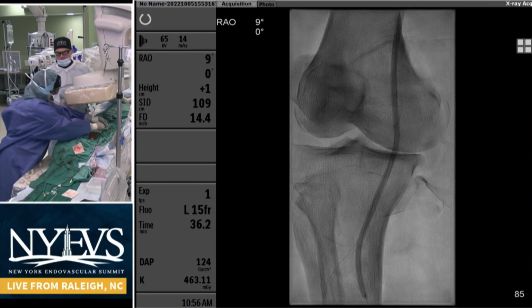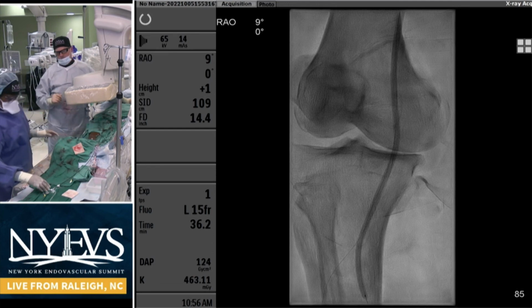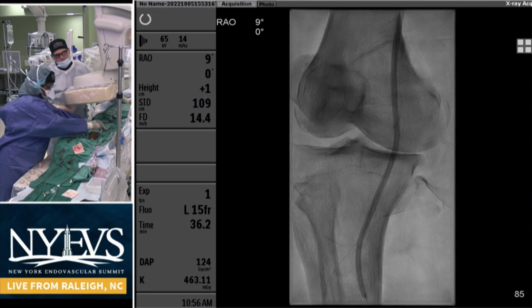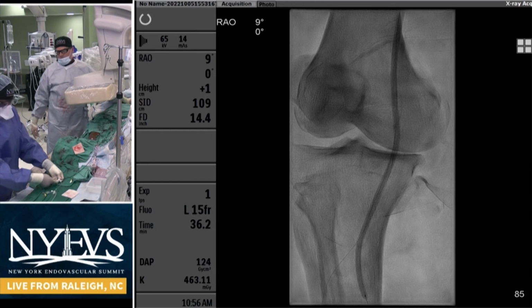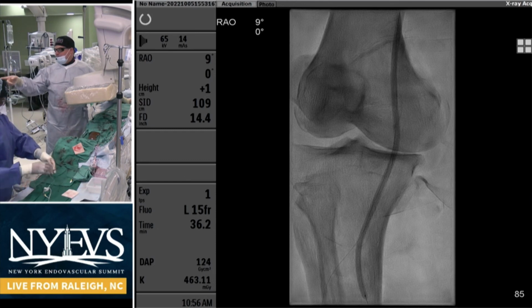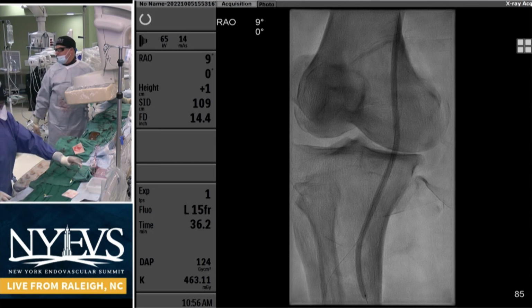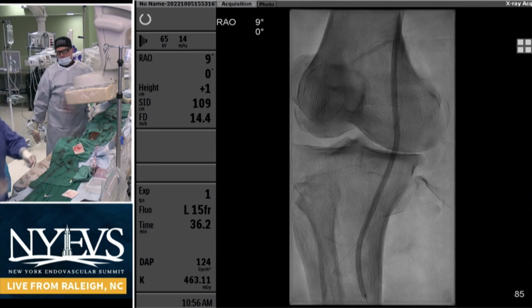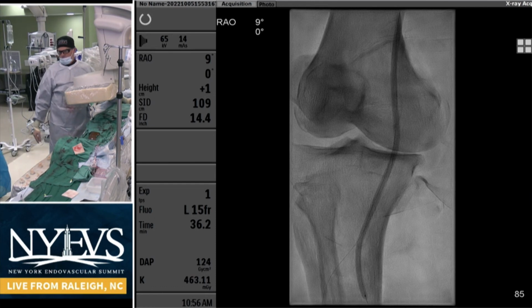Yeah, all right, great. So did you try to rewire from one tibial to the other just to document? I know it's probably more of a feel to feel you're intraluminal in both the tibials, but how would you try to confirm that both the tibials are actually connecting at one spot and don't have 2 planes running in and connect somewhere in, let's say, the mid-pop or the P3 segment? The only way to really do that would be through IVUS for confirmation purposes.